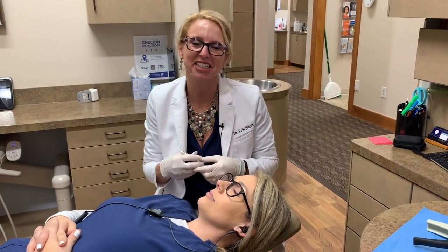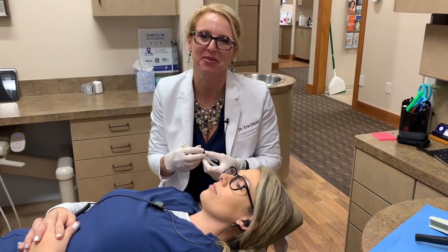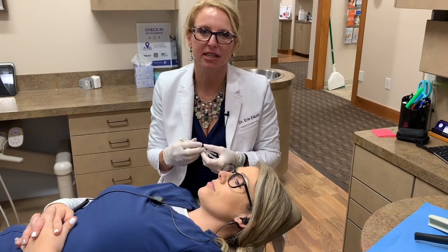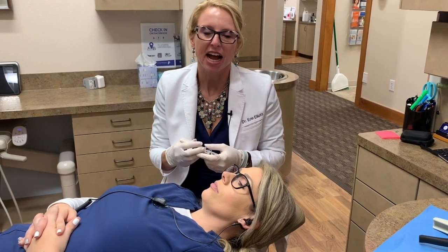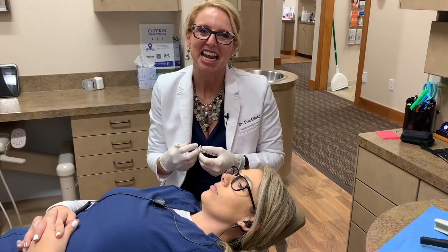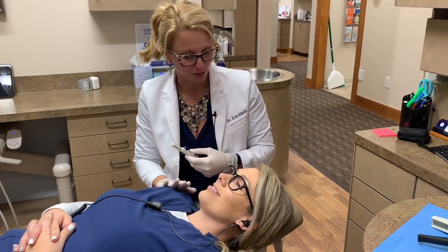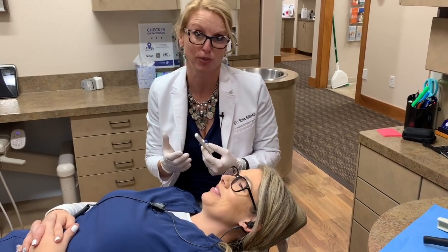Hey everybody. I just explained to you via slides on how to take a bite with the SOMGAGE, but now I'm going to do a demo for you. I really like to use the snore test technique, as I call it, and so I do have a guinea pig. She's willing, so let's get started.